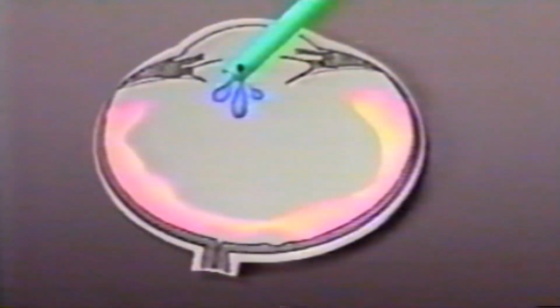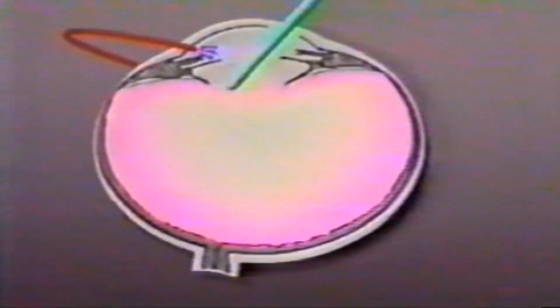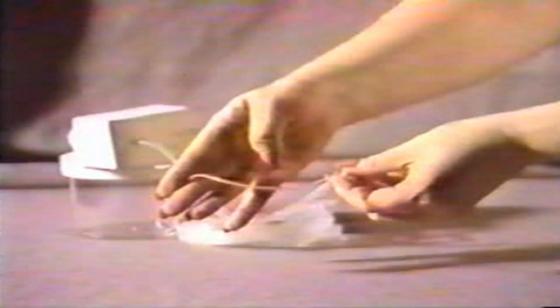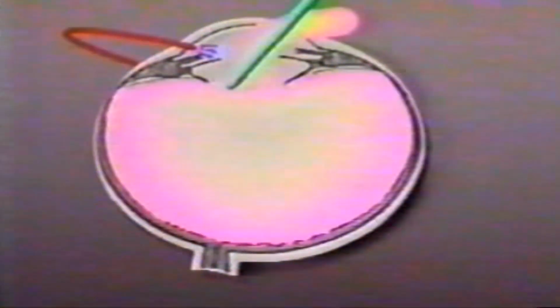In the presence of a PCR with vitreous loss, if a coaxial irrigation and aspiration is used, there can be an extension of the PC rent and increasing hydration of the vitreous. This will lead to vitreous presentation into the anterior chamber. Conversely, using a bimanual irrigation and aspiration or using an AC maintainer, the PC tear gets tamponaded and reduces the amount of vitreous presentation into the anterior chamber. There is minimal hydration of the vitreous, thus allowing the surgeon to do a good anterior vitrectomy and remove the vitreous from the anterior chamber very effectively.